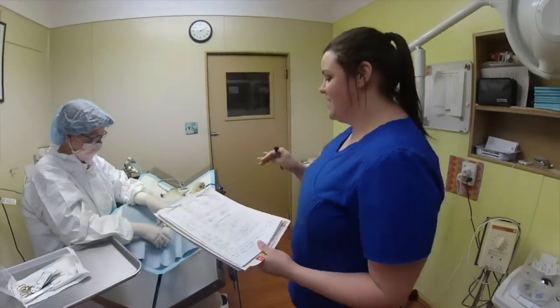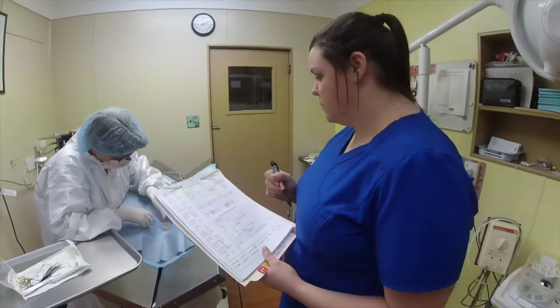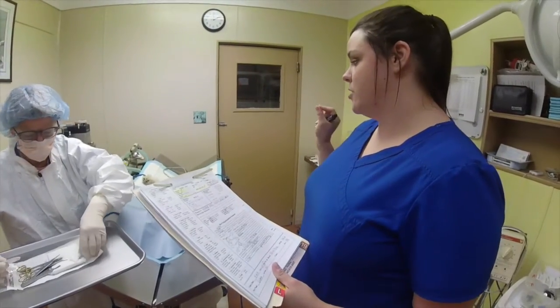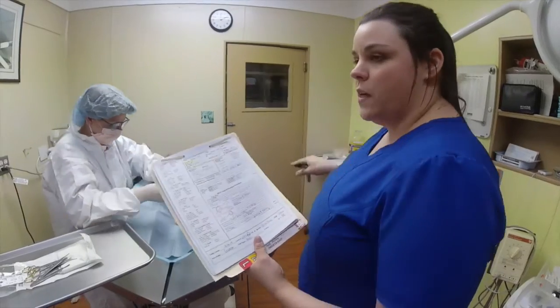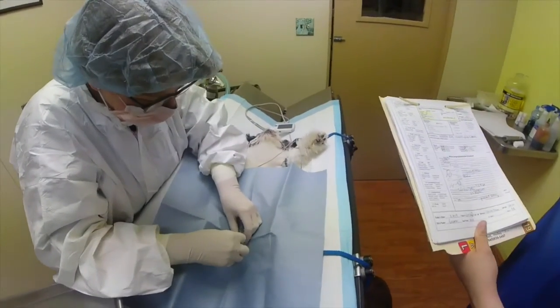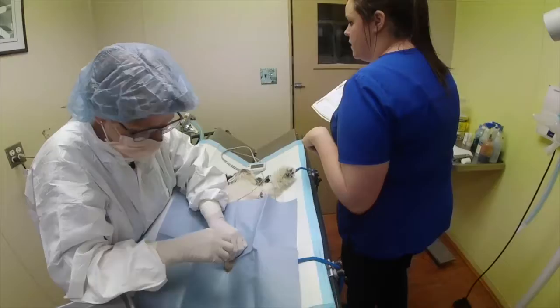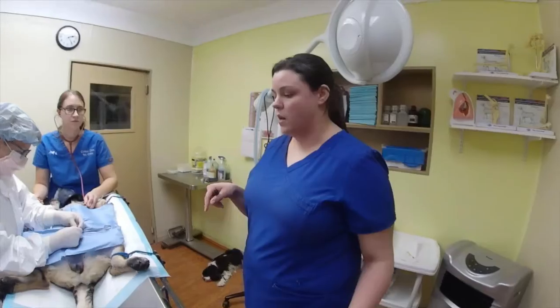Dr. Lindley is doing a neuter on a 6-pound puppy. He's 14 weeks old. We did his anesthesia induction. We're monitoring with our ECG and SpO2 monitor, and then we will have direct contact with him, and we will monitor his temperature every 15 minutes and his heart rate every 5.